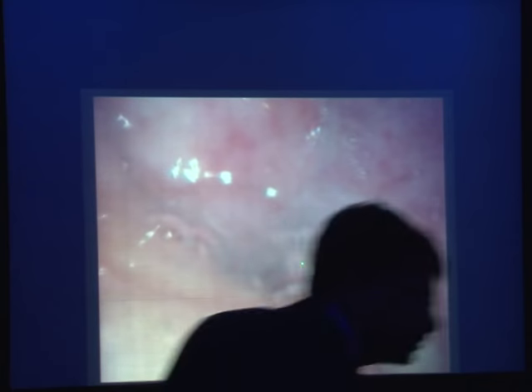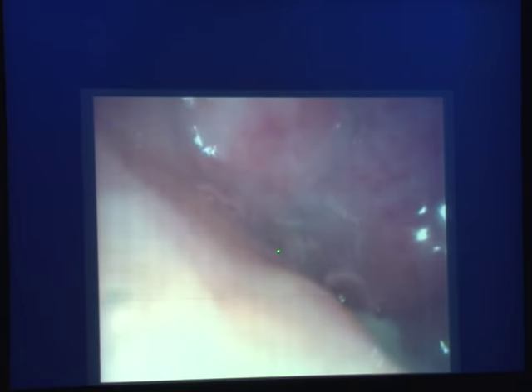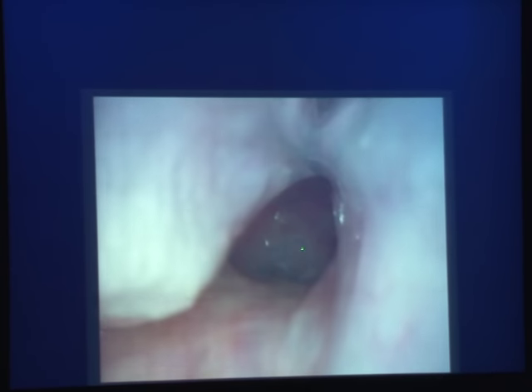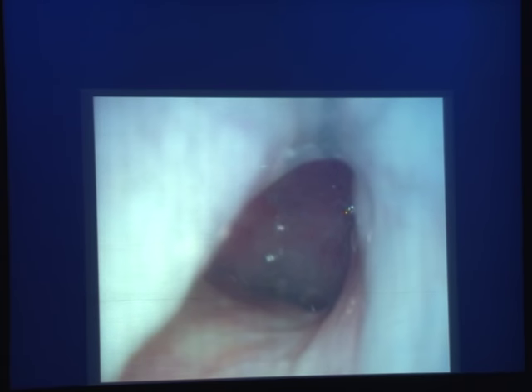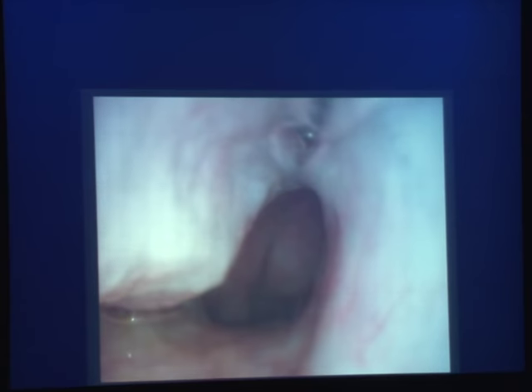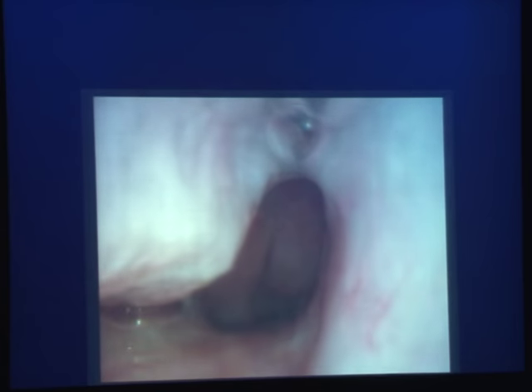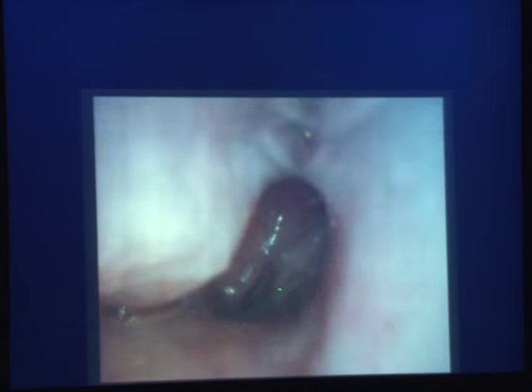Now this patient, if you see here, you can see it's obstructive. He is trying to breathe, but it's not opening up. Now the desaturation will start. I'll let this video play because it's a very, very important video to see. There's no breathing till this time. It's more than 10 seconds already. Now the desaturation has started. Just a little air went inside, but the desaturation is continuing.